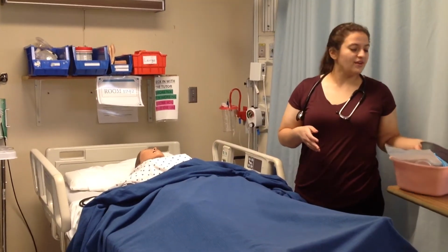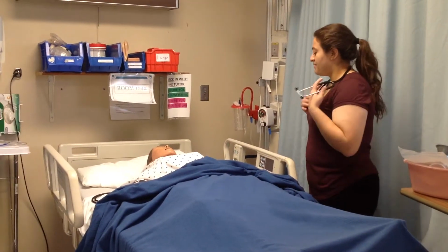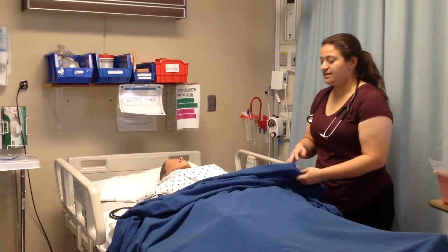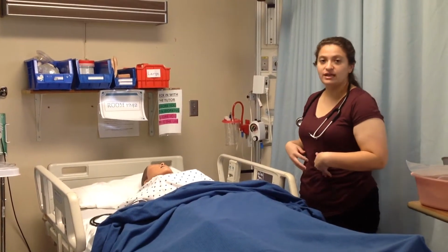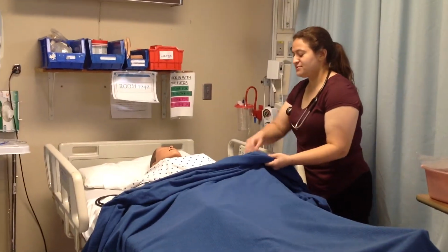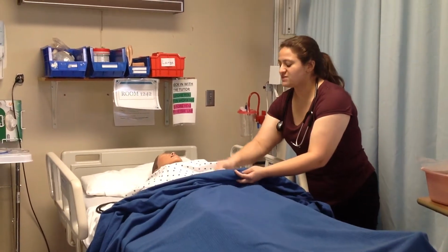So once I explain the procedure to the patient, first I would want to inspect the abdomen, also auscultate, percuss, or not percuss, but palpate, sorry. So, sir, I'm just going to go ahead and lift your gown up and provide as much privacy as possible.